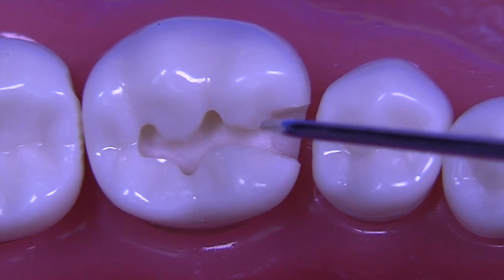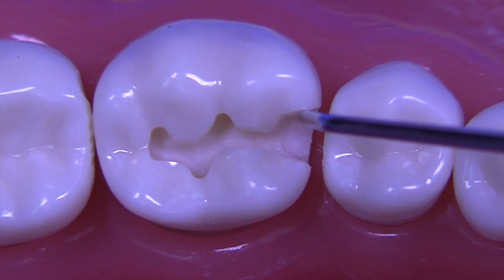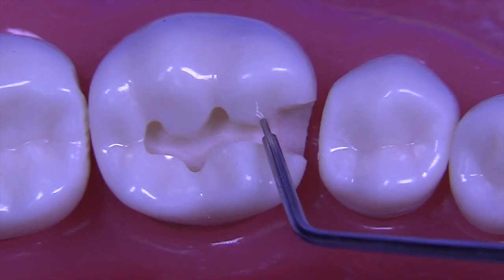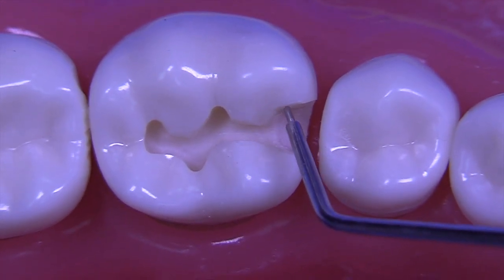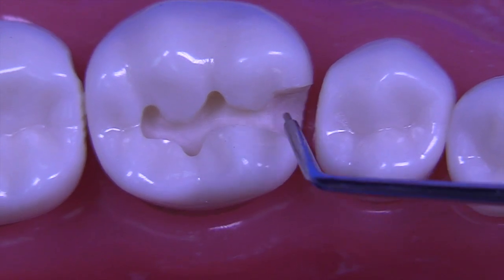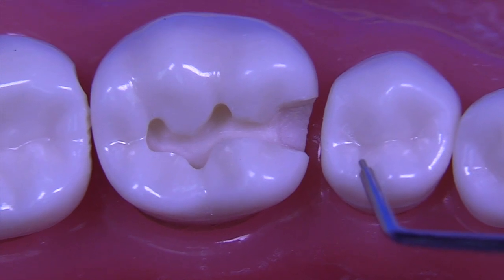So I think that the only thing you could really criticize is the sharpness of your S-curve. If we had just made this a little wider right here and extended into this area, I think you would have had a little bit more of a nice flow of the S-curve. So you're being a little conservative on your S-curve. And that really wraps up outline form.